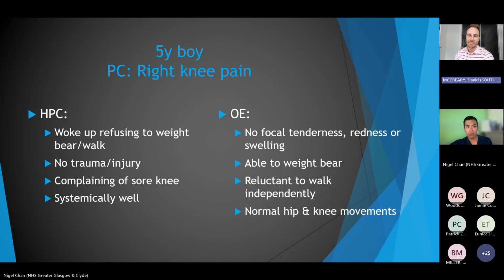Again, they were able to apply that clinical decision rule in a vast number of cases, above 90%. The only time they got it wrong was in 4 cases where they scanned a child within about 12 hours, which can sometimes happen. Ultimately, they looked back and thought it was possible they were rescanned and found that they had an effusion. But those were the only false negatives.